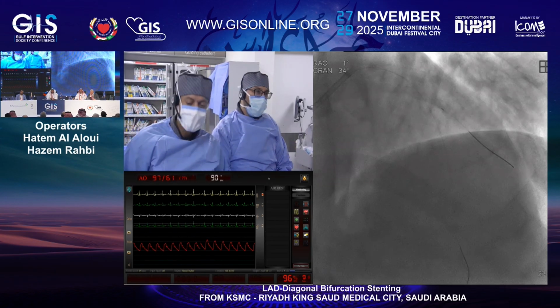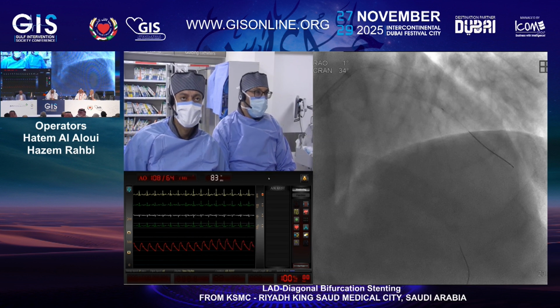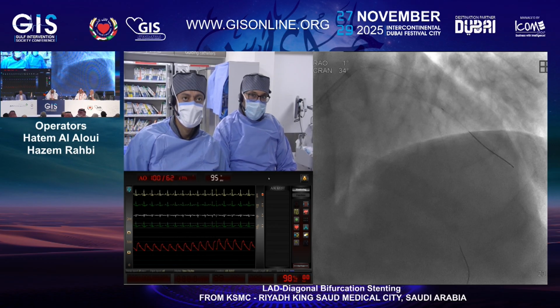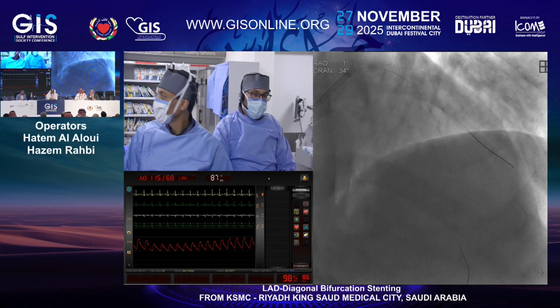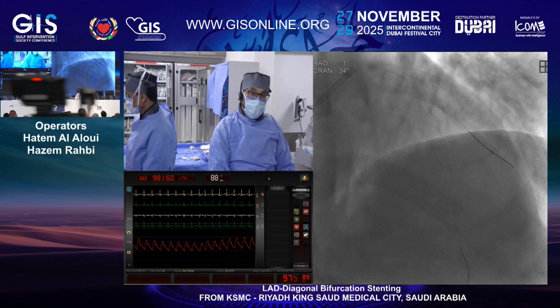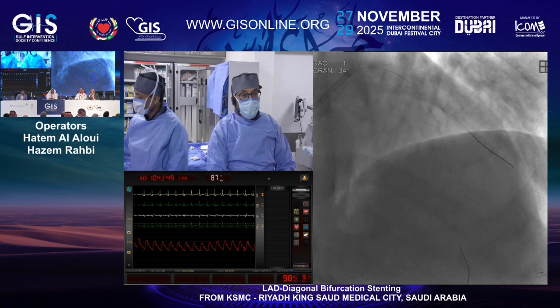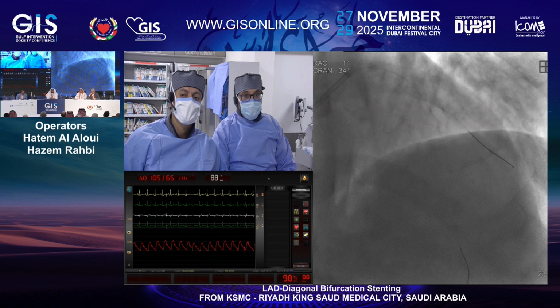We just want to oppose the stent on the proximal segment without being very aggressive there, unless, of course, we have a severe tightening. But here, I don't think that the lesion is stenotic. It's more about positive remodeling. So my aim is just to put the stent there, do an appropriate POT, just enough to have the struts opposed there, and then look at the proximal LAD, how is it? If, as Dr. Gamra said, it gets worse, we'll probably go ahead and complete the stenting. Otherwise, if we have a good result, we just stop there.